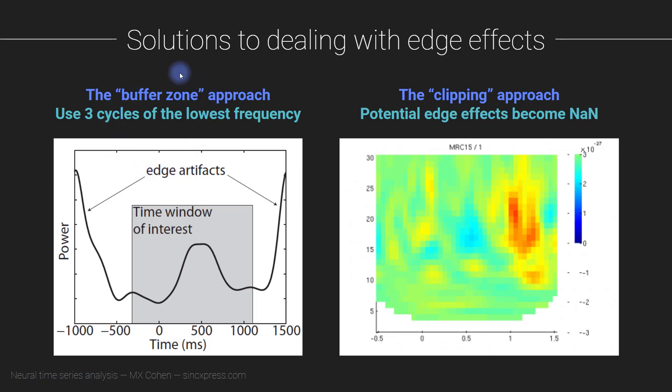OK, so this is my recommended procedure. I call it the buffer zone approach. The other possible way to deal with edge effects is what I call the clipping approach. And here, you don't have to worry so much about cutting large epochs, or you could say this would be a solution for if you are unable to cut really large epochs from the data.